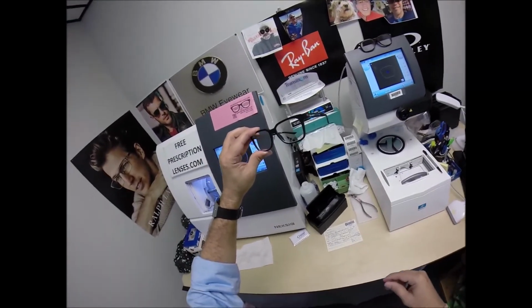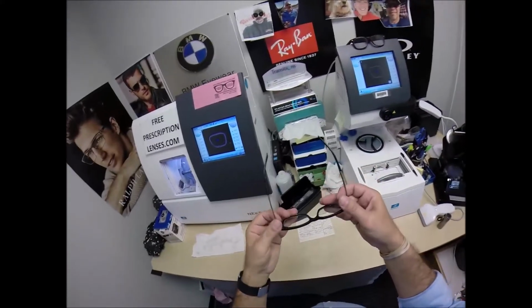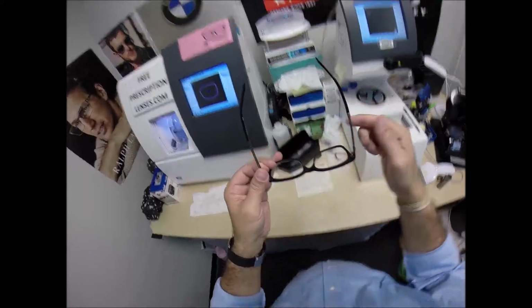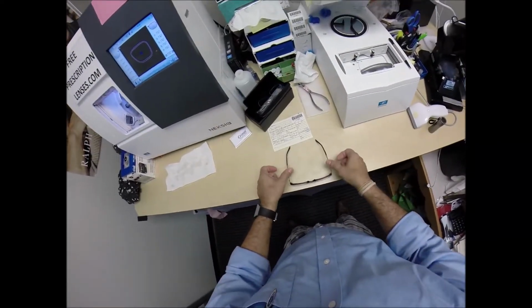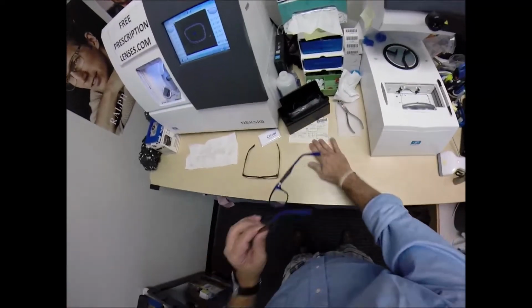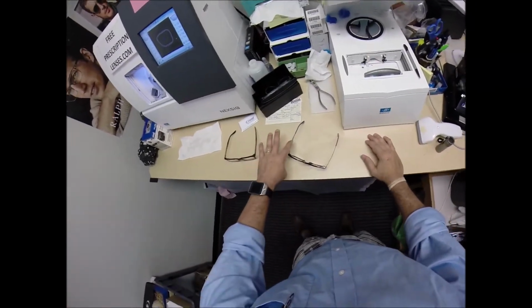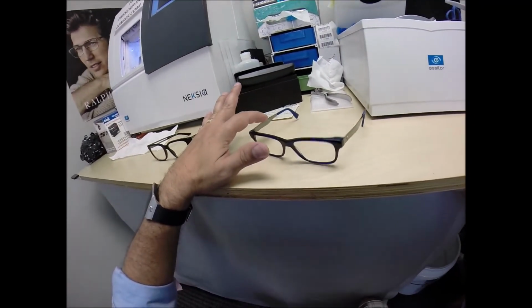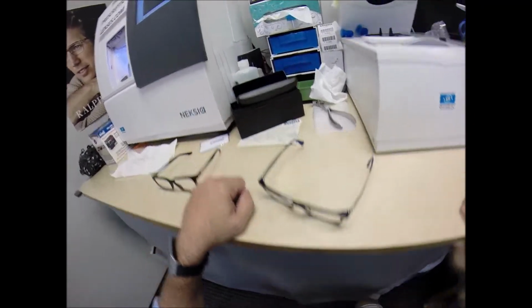But I'm going to get these in standard alignment first, also known as a 3-point stance. The 3 points are 1, 2, and the bottom of the frame being 3. I set them on the counter and press down. There is no wobble. When I say wobble, I'm part of that 80%. When I take mine off and press down, mine wobble on the counter, but they sit level on me because I'm part of that 80%.